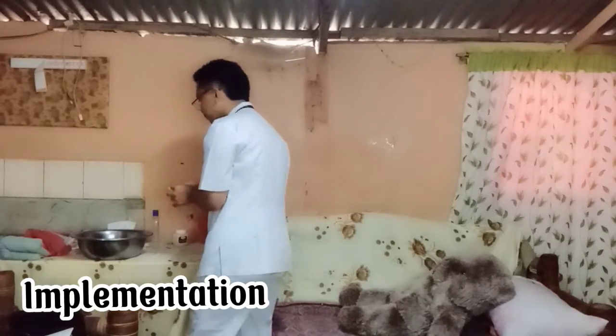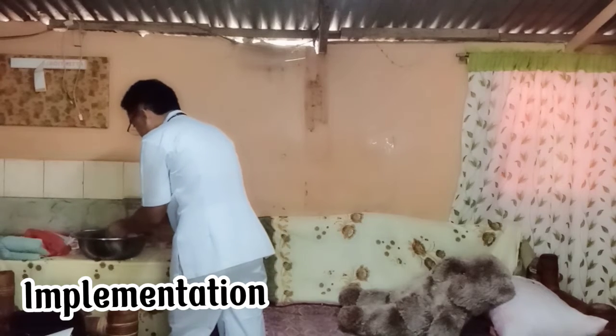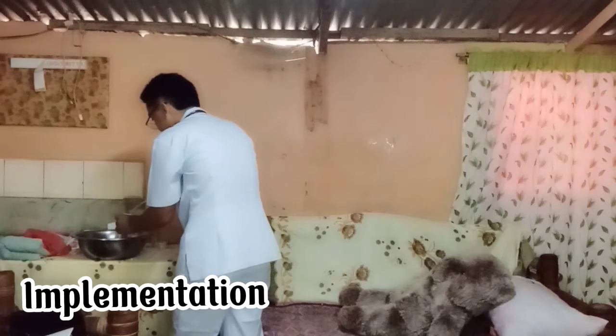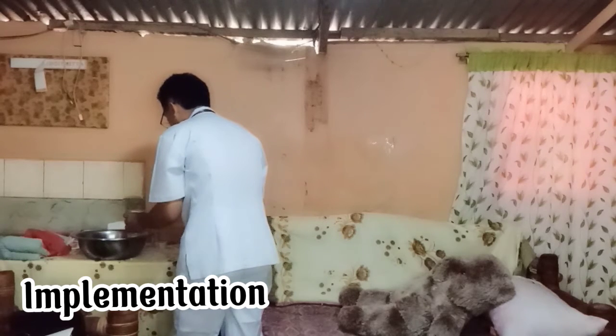So here, we're going to lubricate it. Then I'm going to place it here.